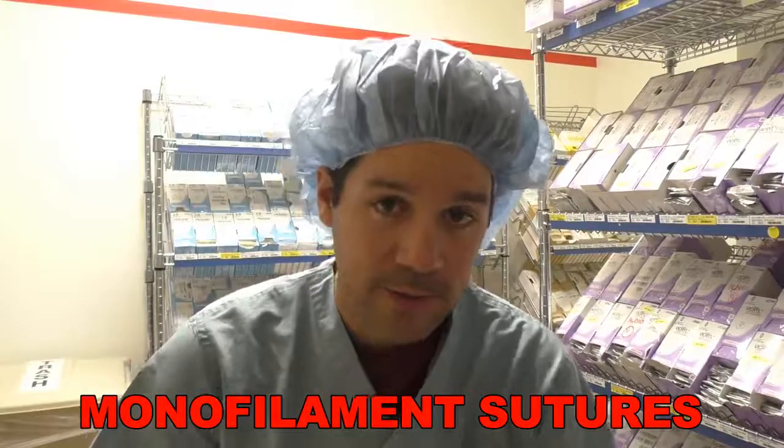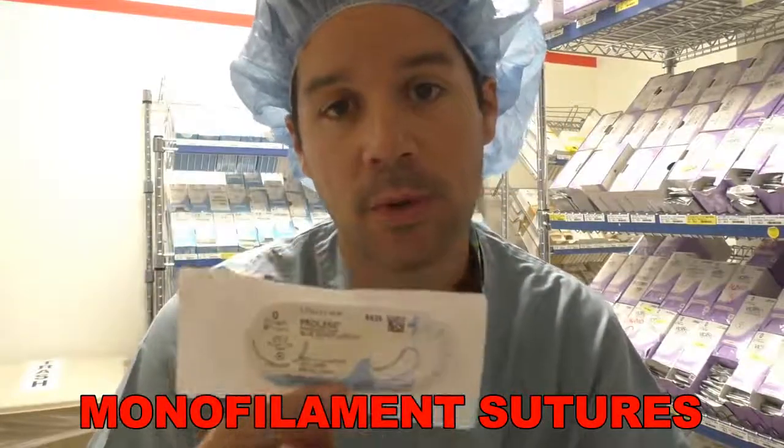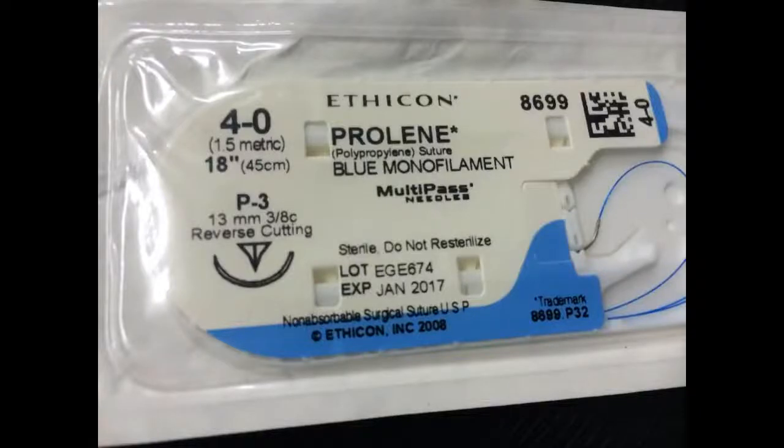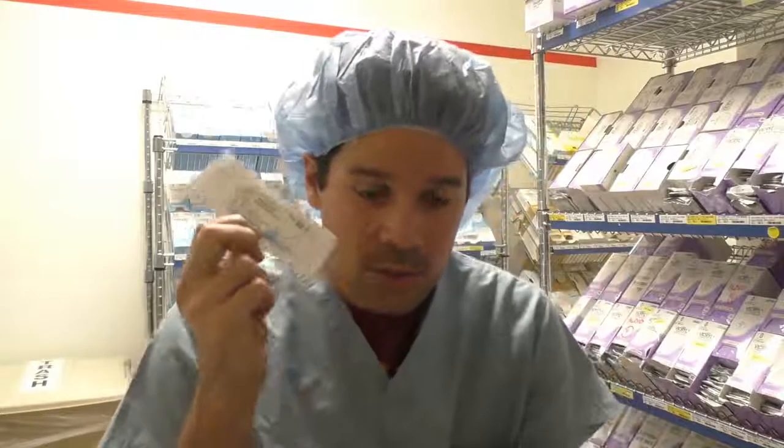I want to start off with the non-absorbables first, and the first one is going to be Prolene. Prolene, the packaging looks very similar to the silk. This is actually a little bit more of a bluish color for the Prolene, and the suture itself is actually dyed blue as well. Prolene suture you will see used all the time in vascular. It is a monofilament, and it is non-absorbable suture.